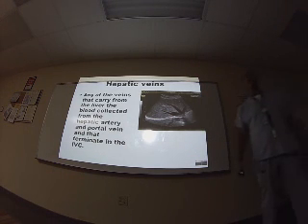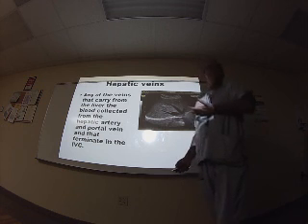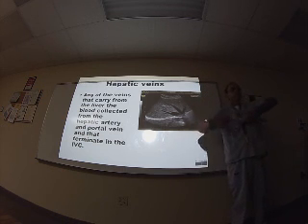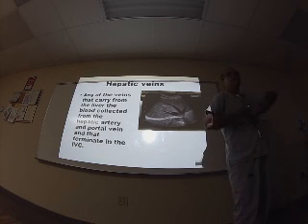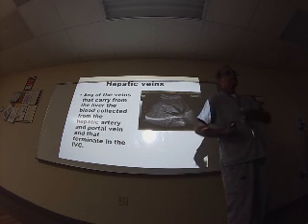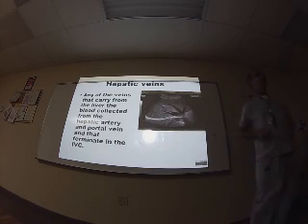Easy to scan. What is the name? La puñalada del cochino. You put the knife here, or the transducer, and you can look at the hepatic veins. Remember, it's a little diagonal. It's transverse, but it's looking toward the right shoulder. You put the transducer transverse, you move a little, and you can find the hepatic veins.